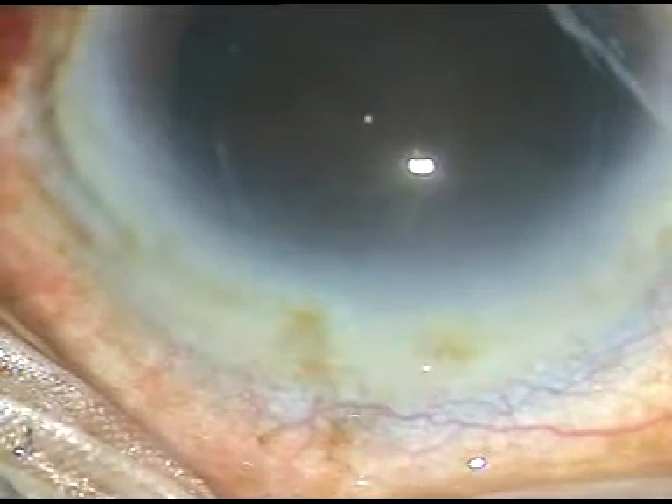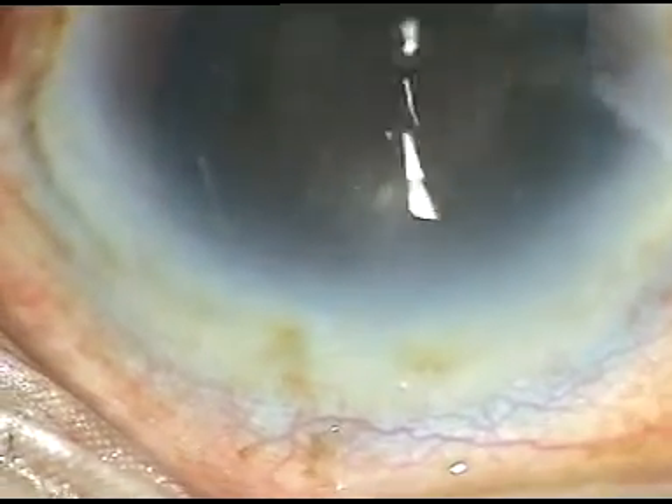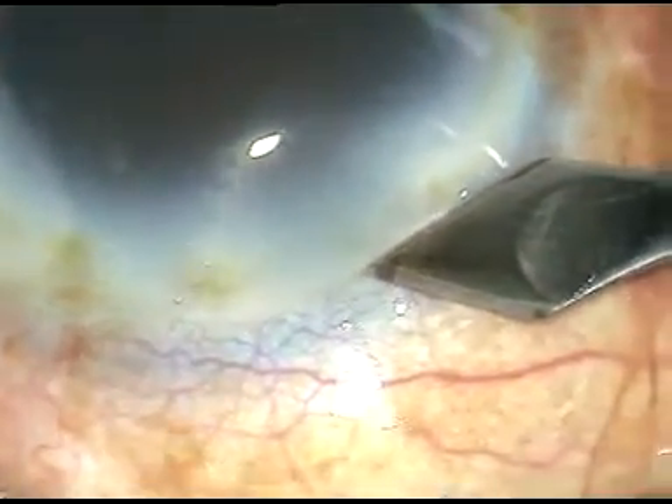Dear colleagues, this is a very hard cataract — cataracta nigra. You can see that the cataract looks black. It is a hard cataract with grade 6 nuclear sclerosis.